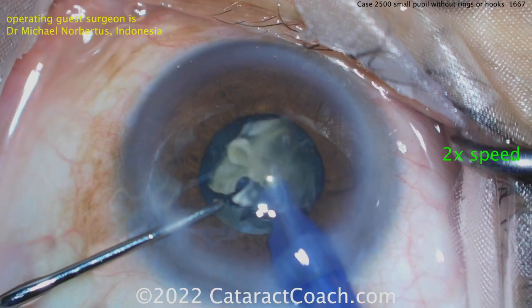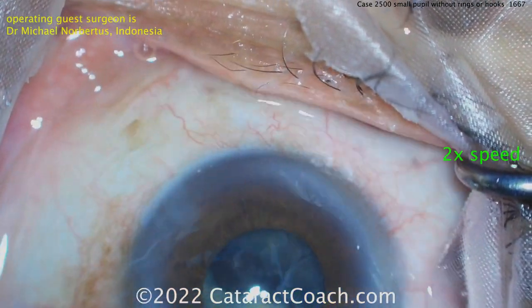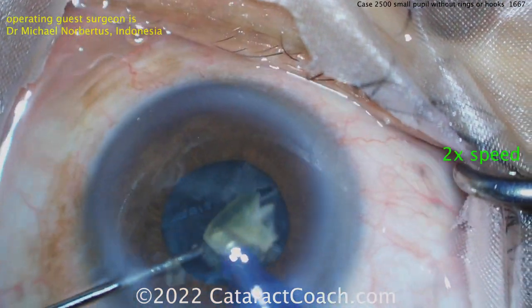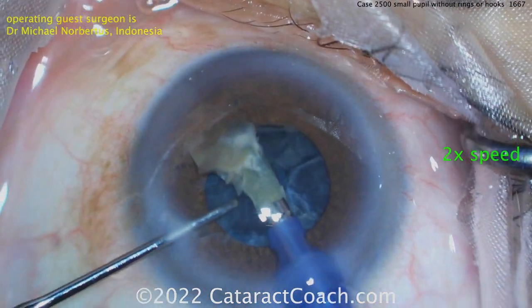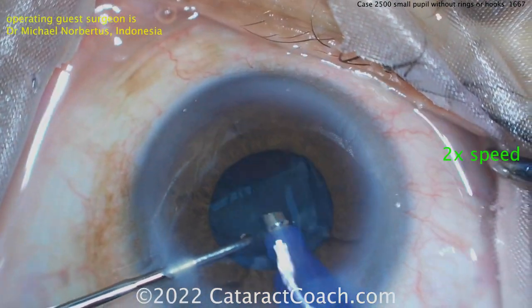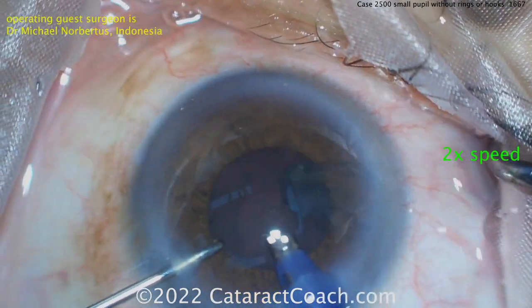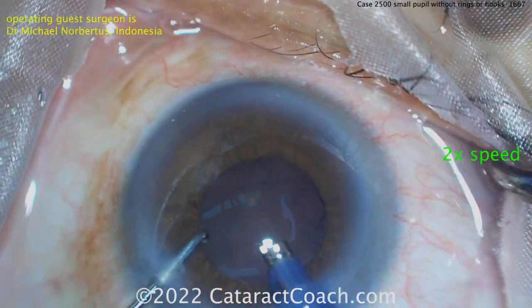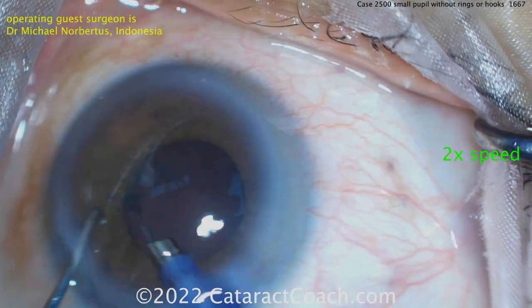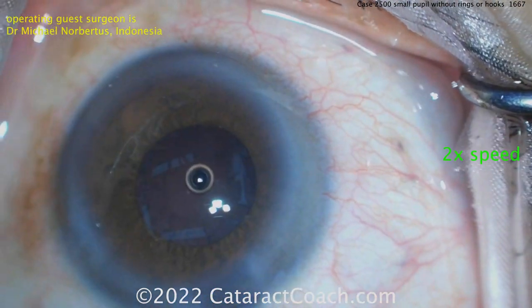In a case like this, at the end of the case I tend to lift up the iris and have a good look around 360 degrees to make sure we're not leaving anything in the bag. When your eye is in the bag and the eye is full of viscoelastic, I like to use the chopper and lift things up 360 and see exactly what's going on. Epinuclear shell coming out pretty easily - wow, fantastic, really impressed.